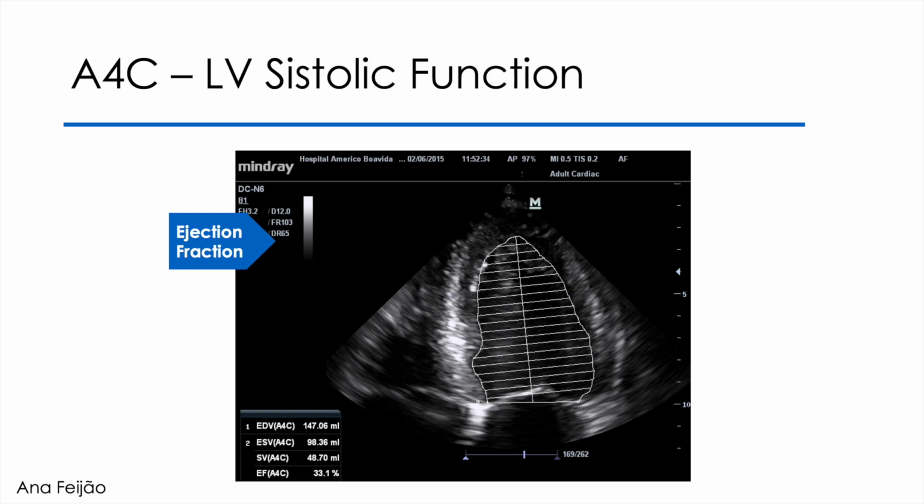telediastole, okay? And define in the software, in the left ventricle menu, the Simpson measurement. And the caliper will appear. We must mark the caliper on the endocardium at the level of the mitral septal annulus and contour the endocardium of the entire ventricular cavity until reaching the lateral mitral annulus. In the measurement, we must include the trabeculae and the papillary muscle inside the cavity.